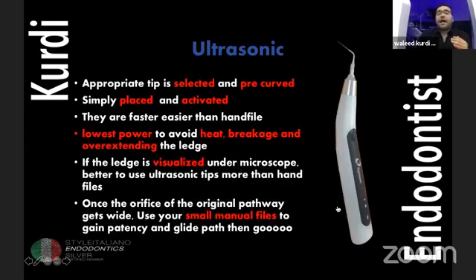Now, I have to tell you that we have a lot of treatment options or even instruments to use in ledge cases. Some colleagues prefer ultrasonic in reducing the ledge and to bypass it. But we have to know that if the ledge is visualized under the microscope, yes, you can use the ultrasonic tip.